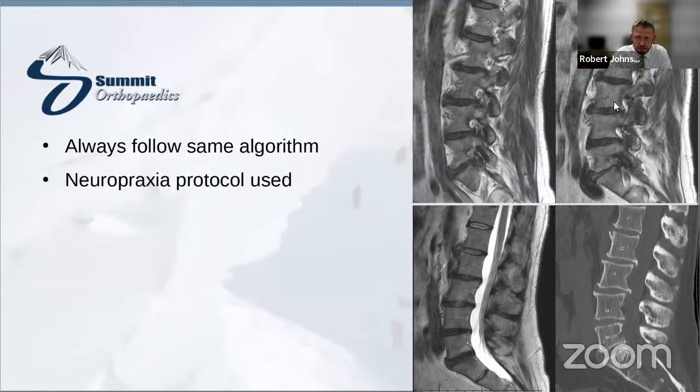This was kind of a discussion between him and I. It was a discussion between the two of us. As we're looking at that MRI, you can obviously see the upper discs at T12, L1, L1-2 still look fairly good, still fairly hydrated. It's really those lower 4 that are having the most issues.